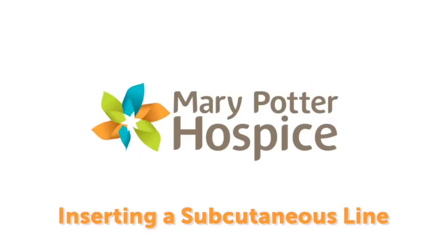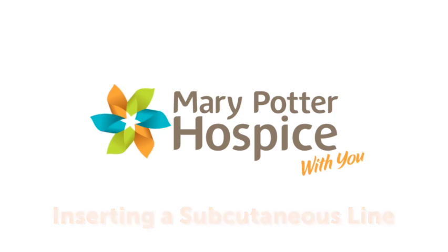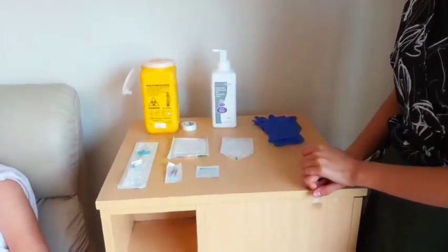This is a video about how to insert a subcutaneous line, or a subcut line, into a patient.